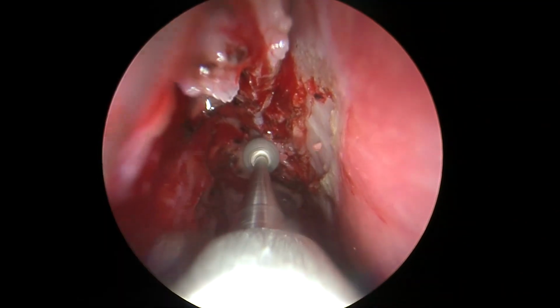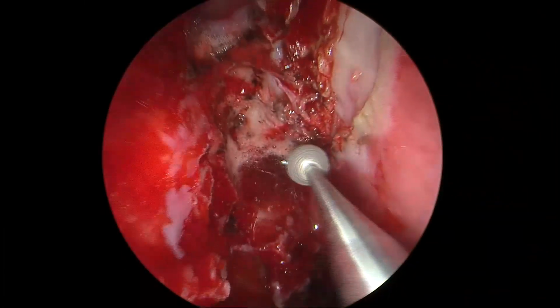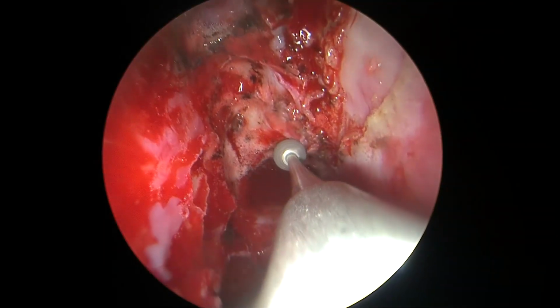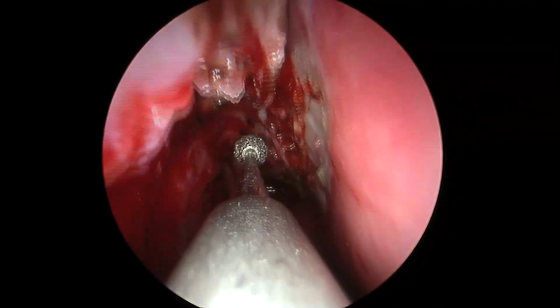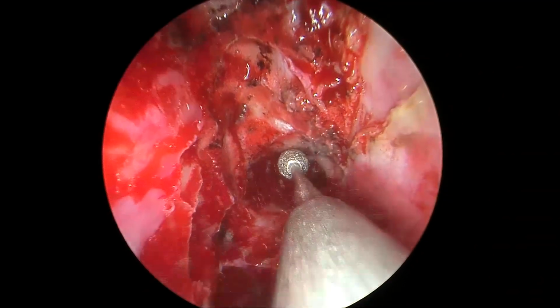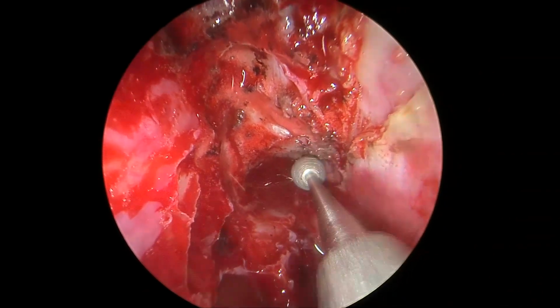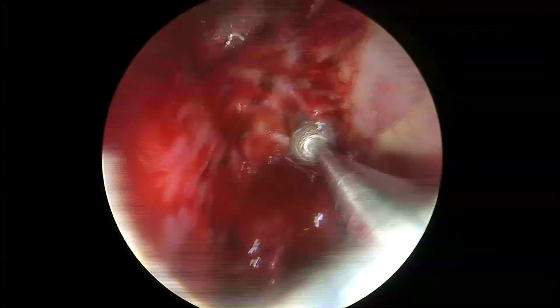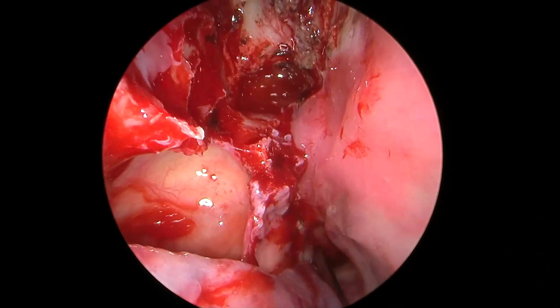For the graft, normally we use the thigh for the fascia lata. If it is a very small graft, one may also use the temporalis fascia, just like in tympanoplasties. But fascia lata is good because it gives you a lot of graft size. It's also thick, and this can be managed quite easily in case one requires a certain amount more graft for a certain patient.